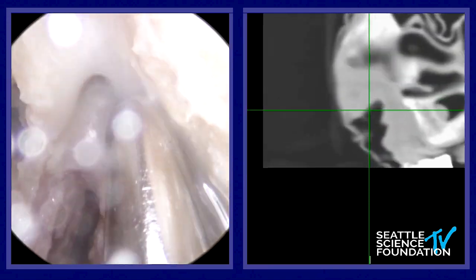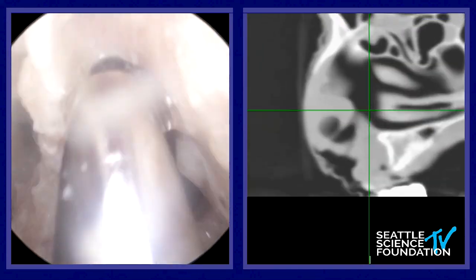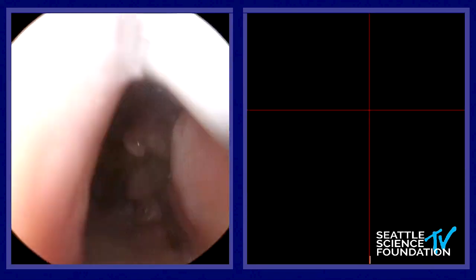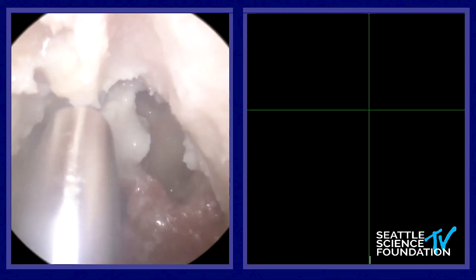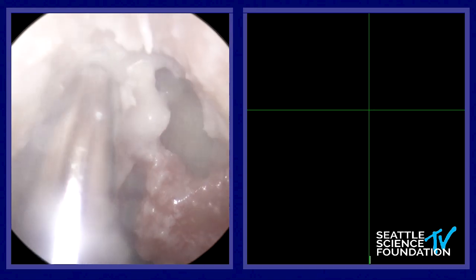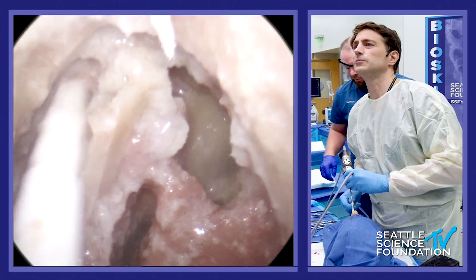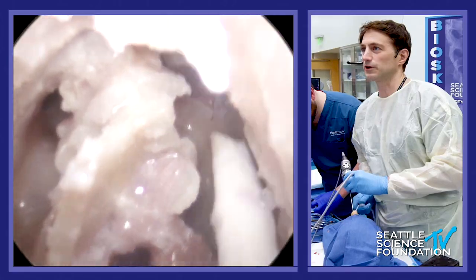Now get in behind here right, and we can hug this. Super simple method to kind of bring this across — again going cross court here. We're going to suction here in a second because I'm super clogged. See how nice and easy this is going to be? It's just going to come right across.